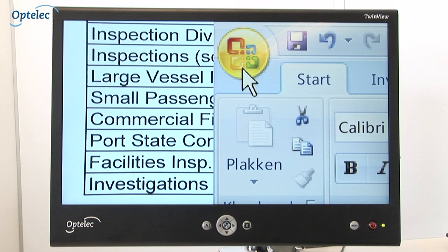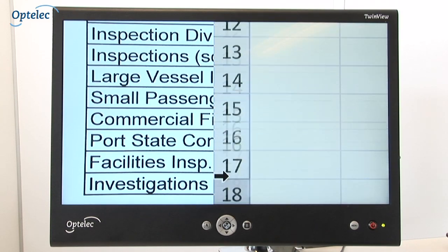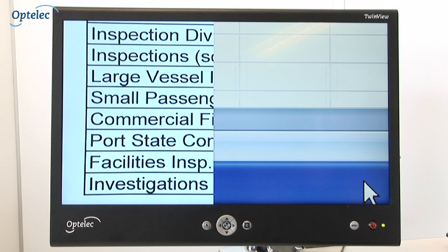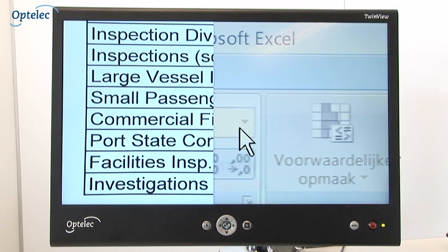If you use magnification software on your computer, such as Supernova or ZoomText, the TwinView will automatically adjust images according to the split screen position. You do not need to make any further adjustments to the settings of either the PC desktop or magnification software. The TwinView makes all the adjustments automatically.